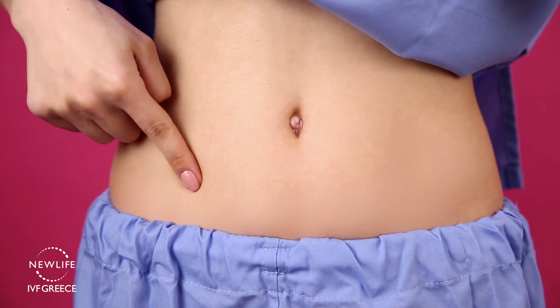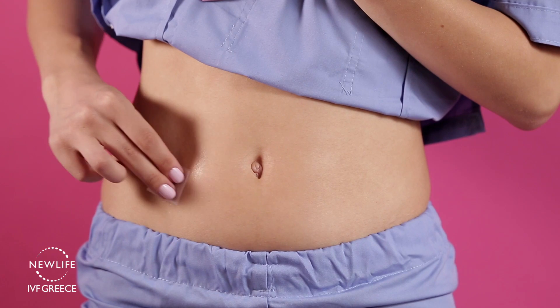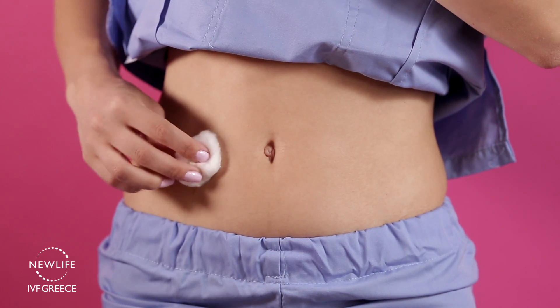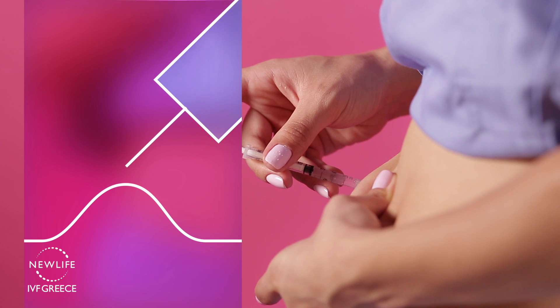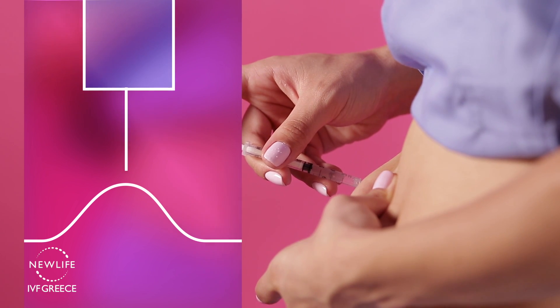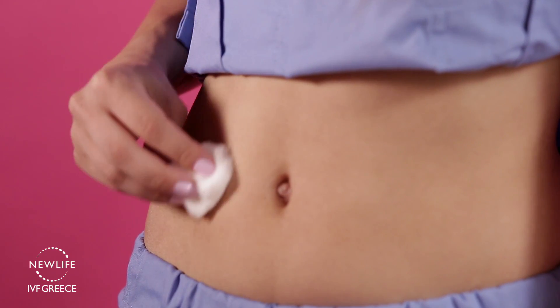Once you choose your injection spot, take some gauze soaked in alcohol, swab the area, and thoroughly clean the injection site. With one hand, pinch your folds of skin and insert the needle at a 90 or 45 degree angle. Depress the plunger slowly and steadily without stopping, and as far as it will go.